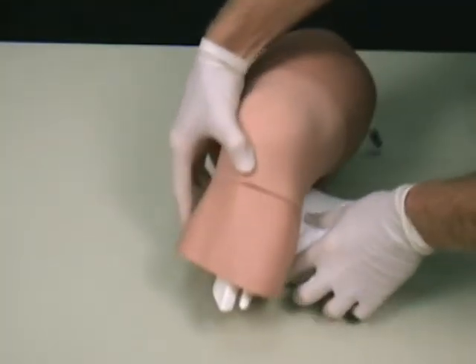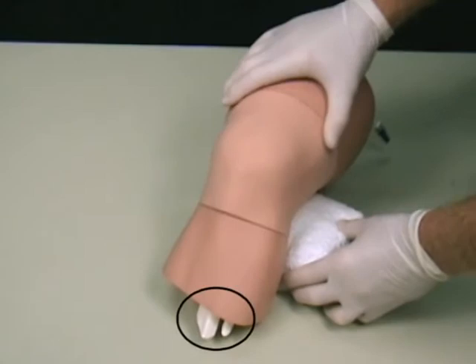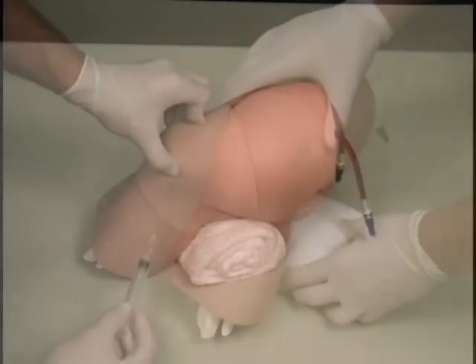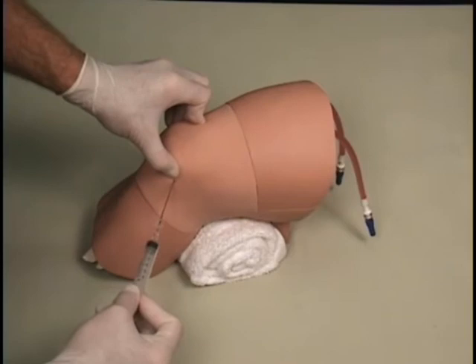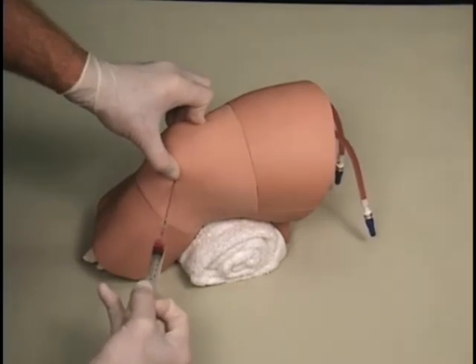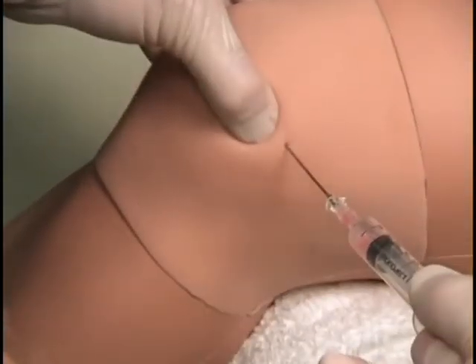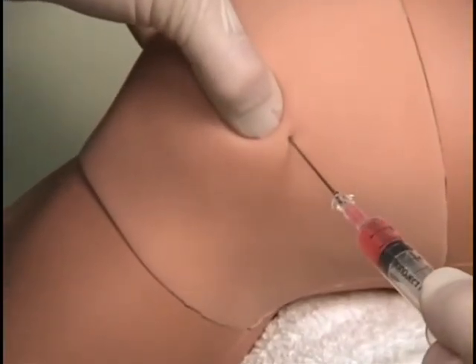For orientation, the base of the model reveals the tibia and fibula bones to indicate that it is a model of a left leg. The ultrasound-compatible tissue can be filled with clear water or water that is colored red or yellow for a desired diagnosis. The tissue is durable for repeated use and it is easily replaced.